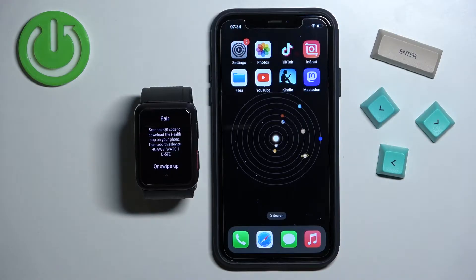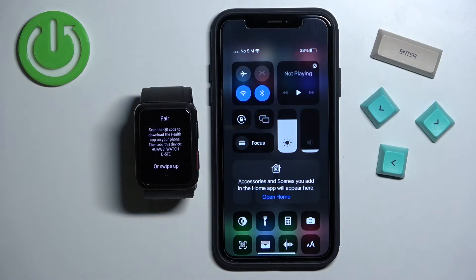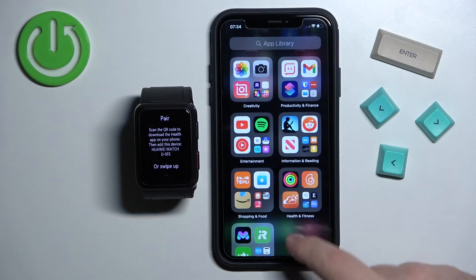Once you select the language you will see a message — basically we need to download and install the Huawei Health application on our iPhone. So make sure you have internet connection and Bluetooth enabled on your iPhone, and once you do, open the App Store.